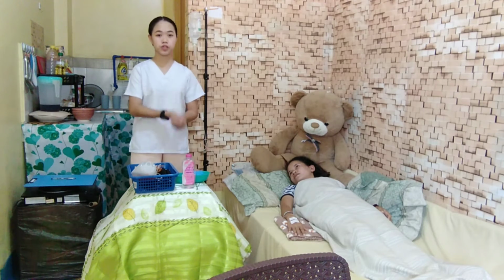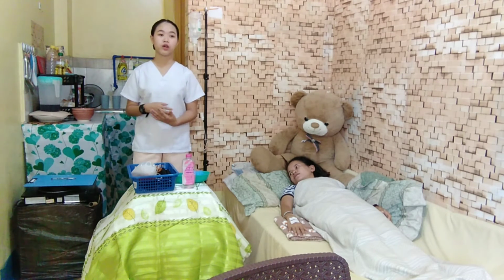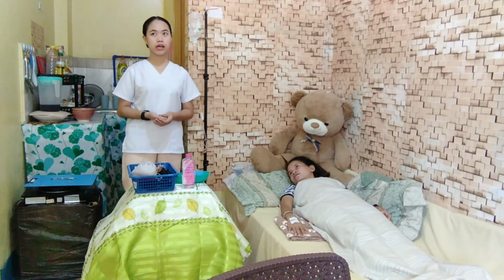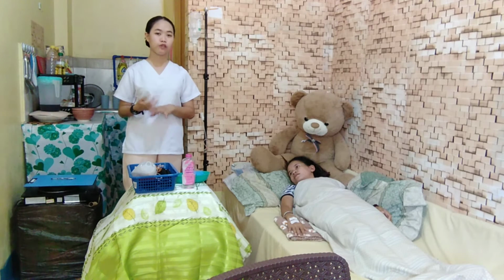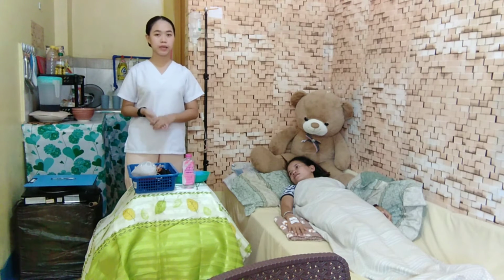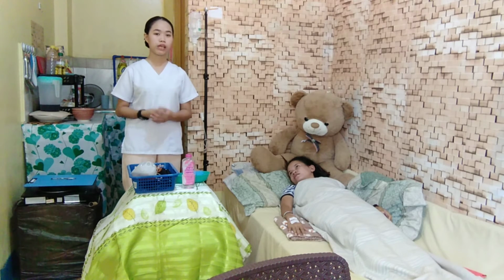For the first step, we will verify the doctor's order: the type of product that we will administer to the patient, the amount of blood, the date and time, the rate, and the duration of infusion.